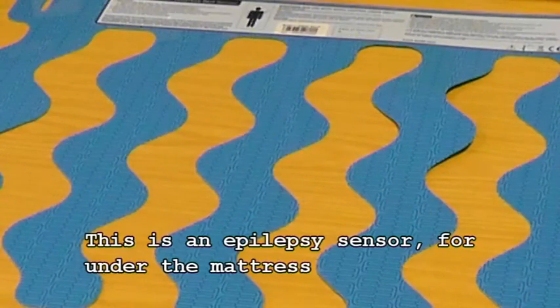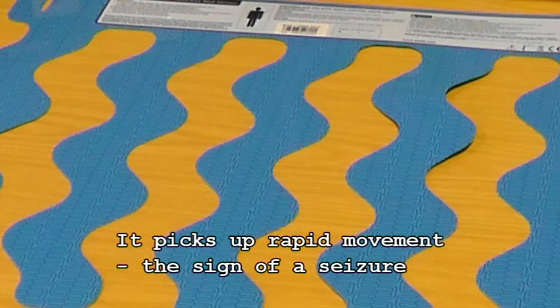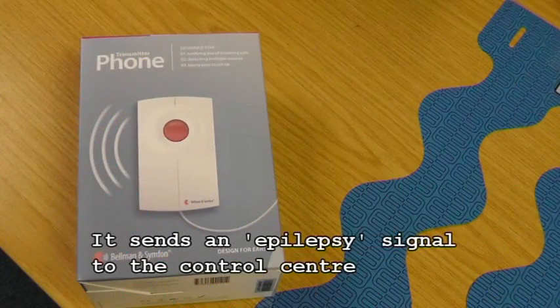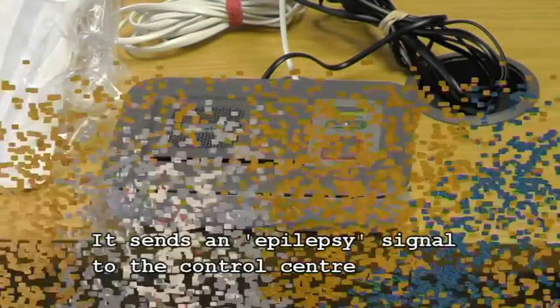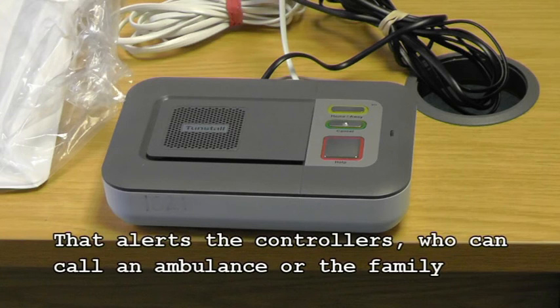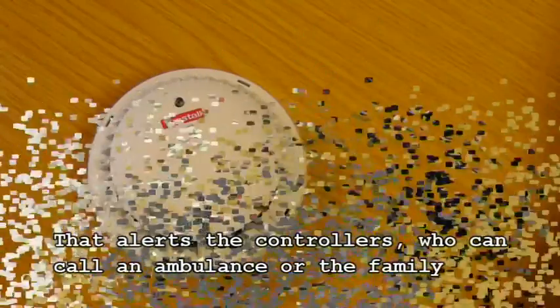Okay, this is an epilepsy sensor. This is designed to go under your mattress and it picks up any rapid movement when people are having a seizure. Once it picks up rapid movement, it sends a call through to the community alarm box where it would come up through the control room, epilepsy. So the controllers would know that the service user is having a seizure and the controllers could contact the ambulance or the family if needed.